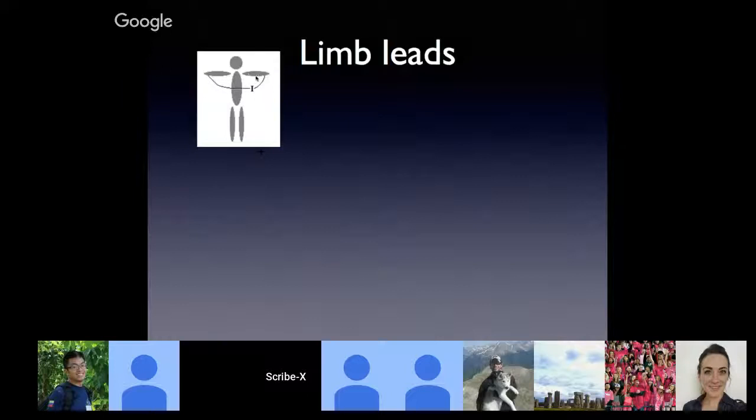So it's as though a camera is stationed on the left hand looking towards the right hand. And if a voltage change across the heart is coming towards the camera, if the voltage is propelled right to left, then the lead will deflect vertically upwards on the EKG paper.